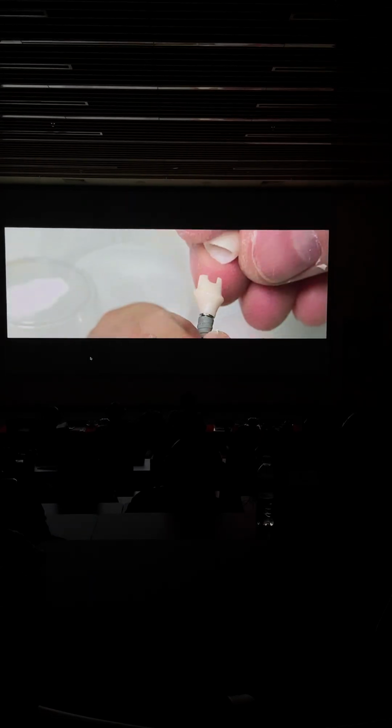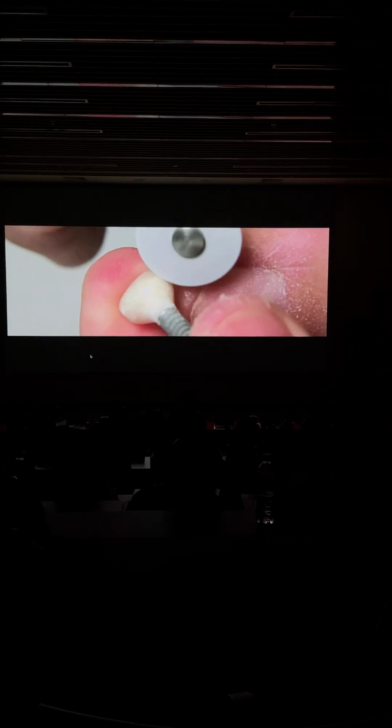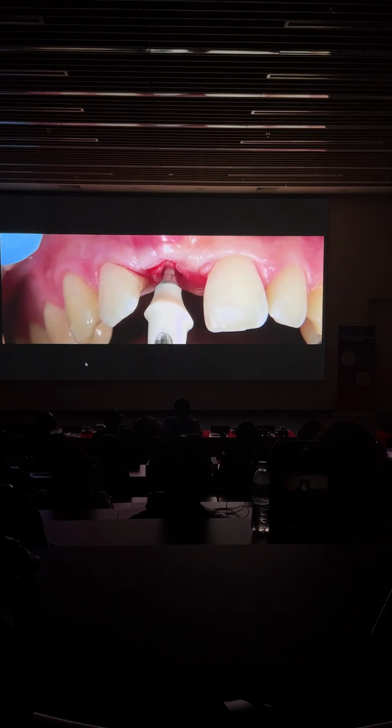You cannot pretend to have a perfect fit. We take it out and we add acrylic if necessary. There is no secret in prosthodontics, and it's polished, and more polished. And then you will see the tissue is coming back. Take out the abutment, you go straight with your final abutment from screw retained provisional, doesn't matter.